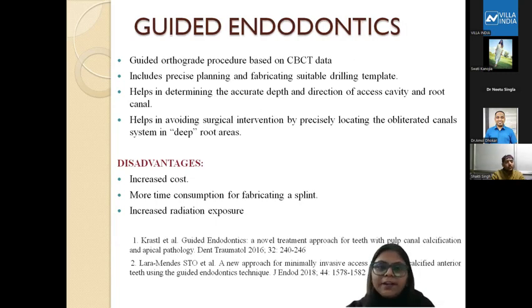Then a new concept of guided endodontics has arrived recently. Guided endodontic procedures are based on CBCT data, and include precise planning and fabricating a suitable drilling template. It helps in determining the accurate depth and direction of the access cavity and the root canal, and it also helps in avoiding surgical intervention by precisely locating obliterated canal systems in deep root areas. Some of the disadvantages of guided endodontics are the increased cost, obviously more time consumption because a splint has to be fabricated, and the increased radiation exposure.